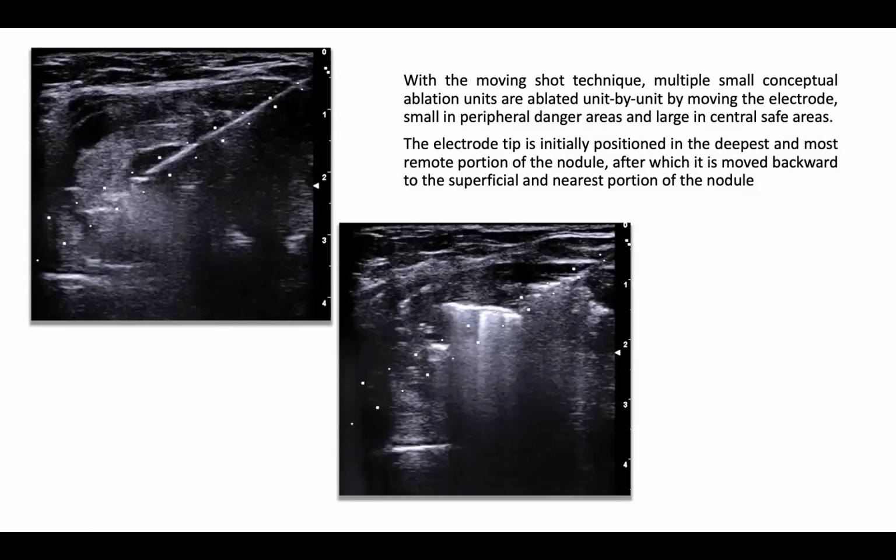This is the excellent view of this electrode. The quality of visualization of the electrode used here, 18G, is extremely good in every phase of the procedure. This allows us to control precisely the location of the needle and also the progressive formation of gas, seen here in the lower image, which should reach for every procedure, possibly the capsule, the peripheral capsule of the nodule.